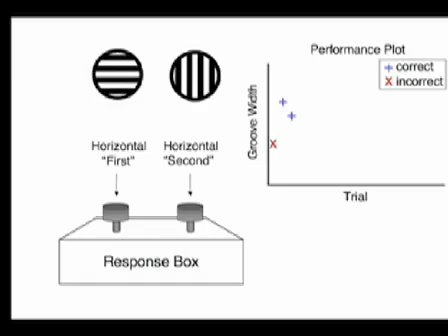This sequence of events continues until the designated number of trials has been presented. We typically run blocks of 40 trials.